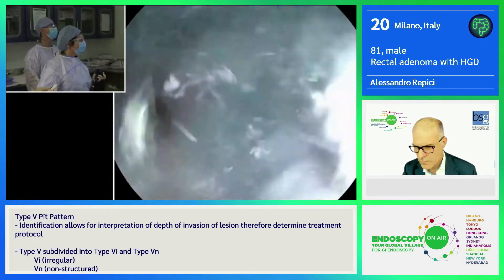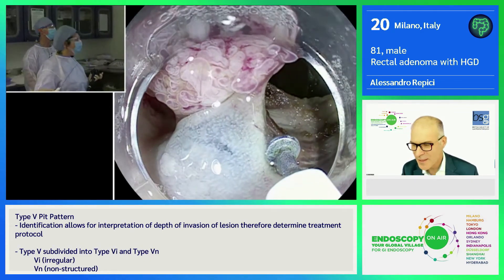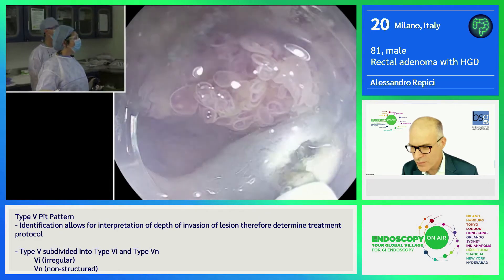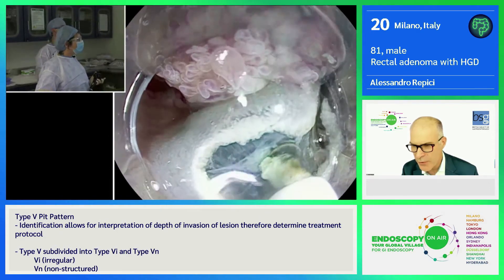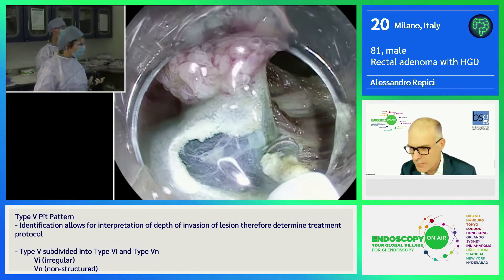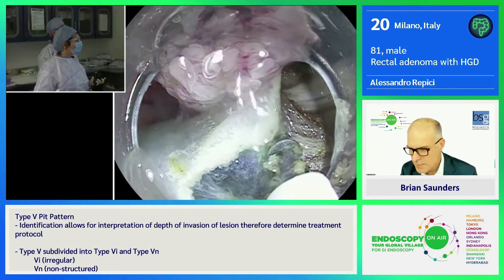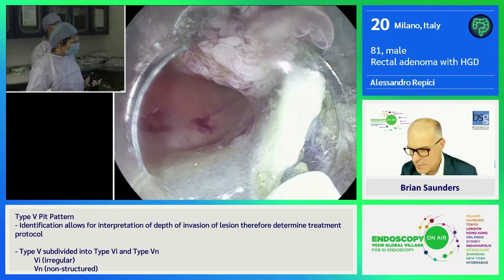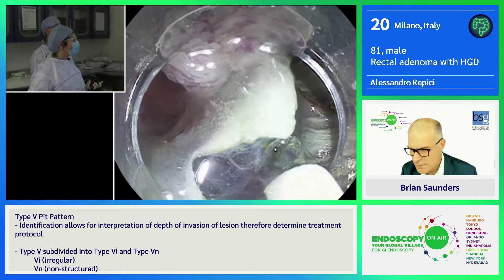So I can easily inject. Brian Saunders here. Then I will get the traction and cut. You've almost finished — looks like a very nice dissection. How long has it been going? Check for the submucosal layer. This is the beauty of the hybrid knife: you can inject and easily cut. We are using the section width. I know that you're also testing it when you do POEM.